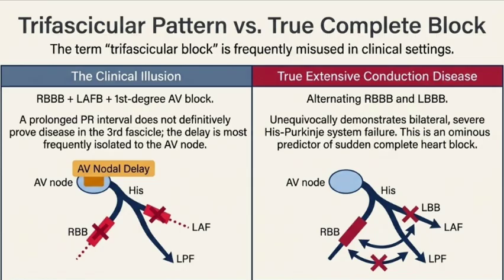A really great way to think of ECG leads is to imagine 12 different security cameras mounted in a circle around the outside of a building. And the building is a heart. Right. Each camera, or lead, is just looking at the exact same electrical event from a slightly different angle. Some cameras look from the bottom, some from the left side.